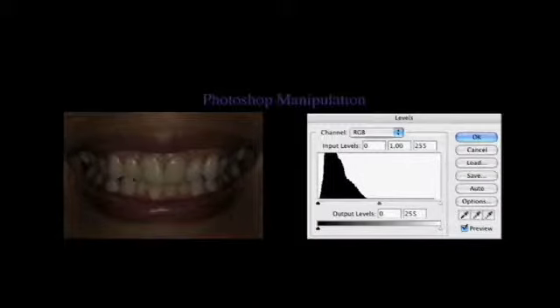And then if we take this image here, this is another image, different than what we saw. Certainly if you looked at this, you'd go, well, that's underexposed, Brian. Come on, what's wrong with you? And I agree, right? And the histogram tells us that. Okay, so this is the histogram of this image. So if you were doing this clinically, you'd want to add a little bit more light to this picture. So like I said, you'd maybe bump up your flash.